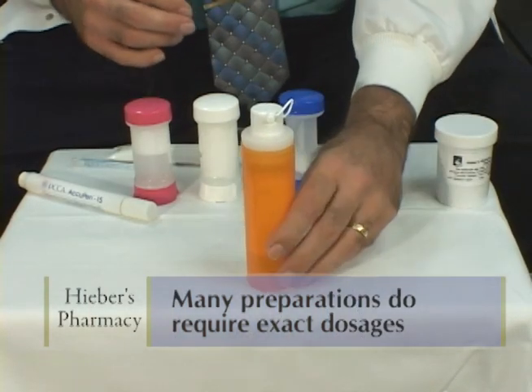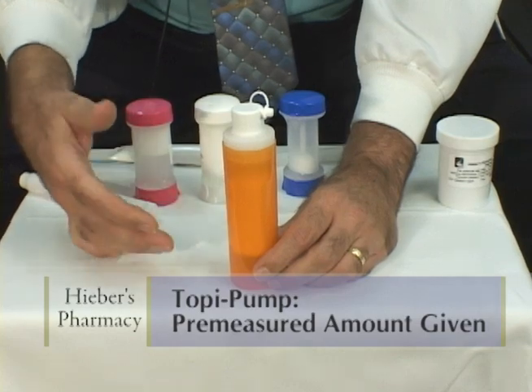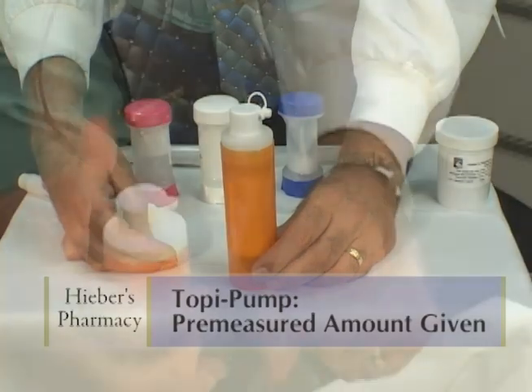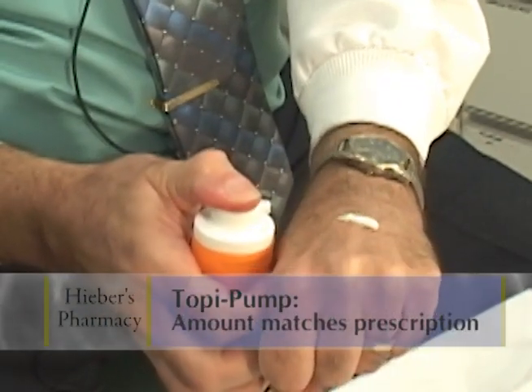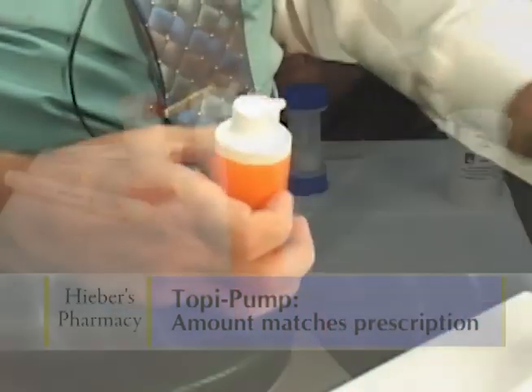I have a few devices here I'd like to show you and demonstrate how they're used. This is called a Topi-Pump, and all one has to do is just give one actuation and that gives a pre-measured amount of the cream according to the doctor's prescription.